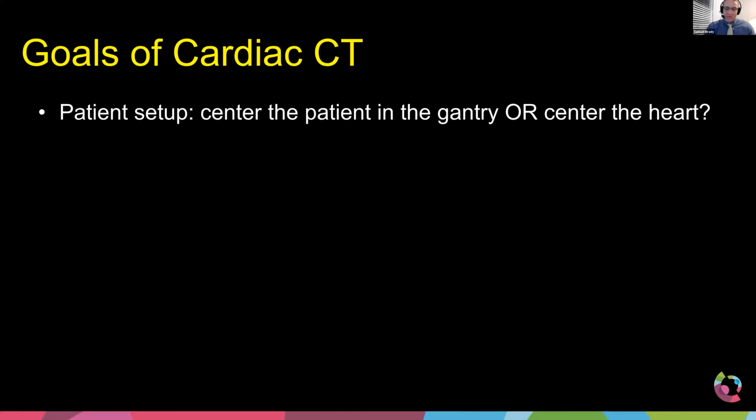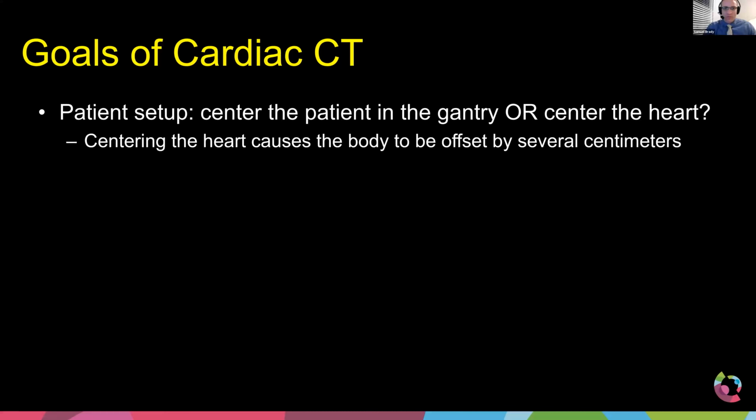And then one of your wonderful viewers said, tell me more about Hitachi. So I did a lot of reading about Hitachi this week. And guess what? Hitachi actually has a very specific bow tie filter meant for cardiac imaging. This may have been the exact same person that asked these two questions. I'm not certain, but that's very astute. This is something I didn't know, so I have to admit, I learned something new this week.